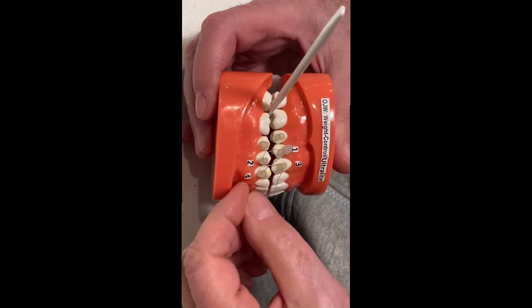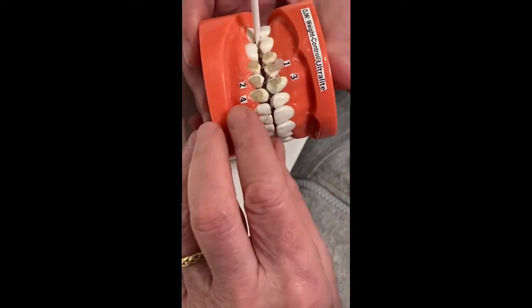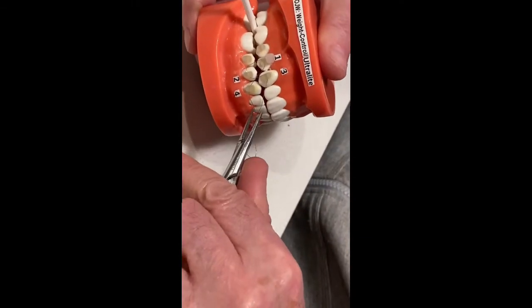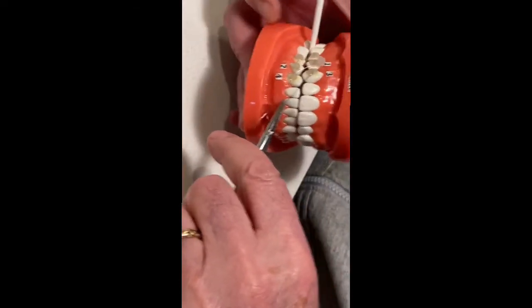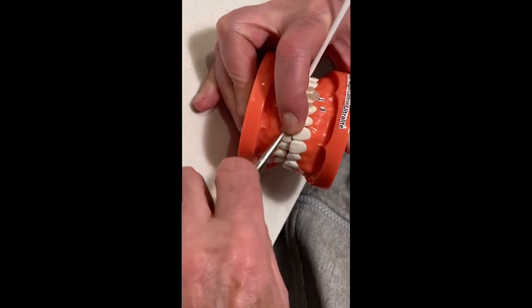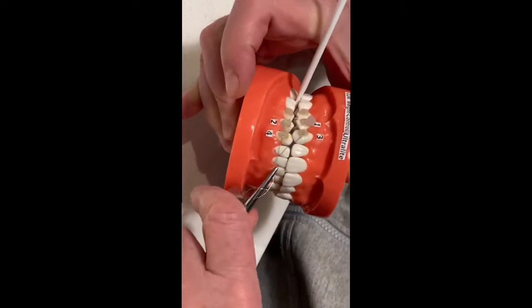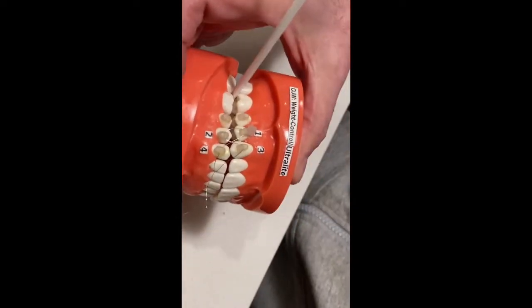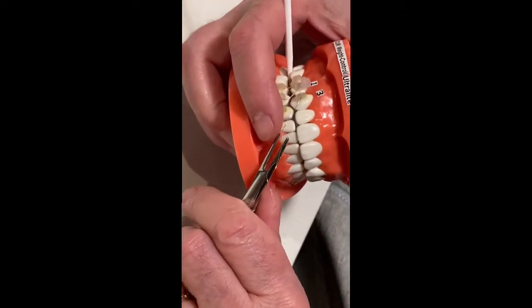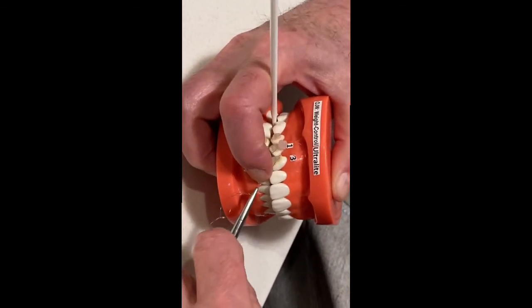Now, you bring the ends together. You take your twisting instrument and you start bringing it together. You can take your finger, and this will help you so that you can twist the ends and take up the extra slack. Do you see how that's happening? Then continue getting it tighter and smaller, but not all the way, almost.